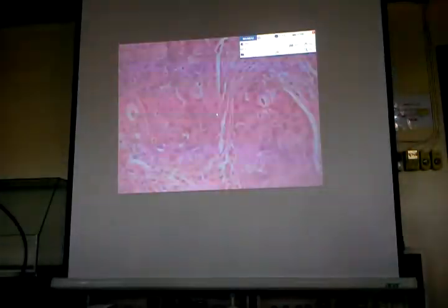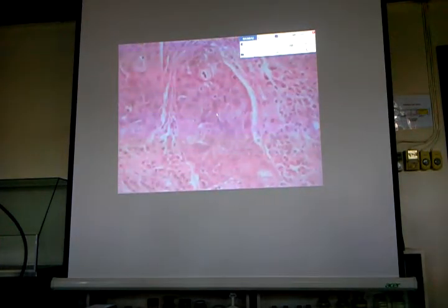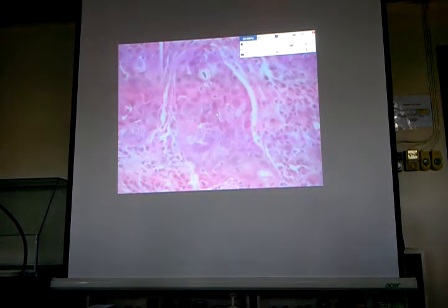And then how will you describe the nuclei that we are seeing? Are they uniform in size and shape? No. So what is the term for that characteristic? There is pleomorphism displayed by the cells that we are seeing. So that is one type of cell that is present in this neoplasm.